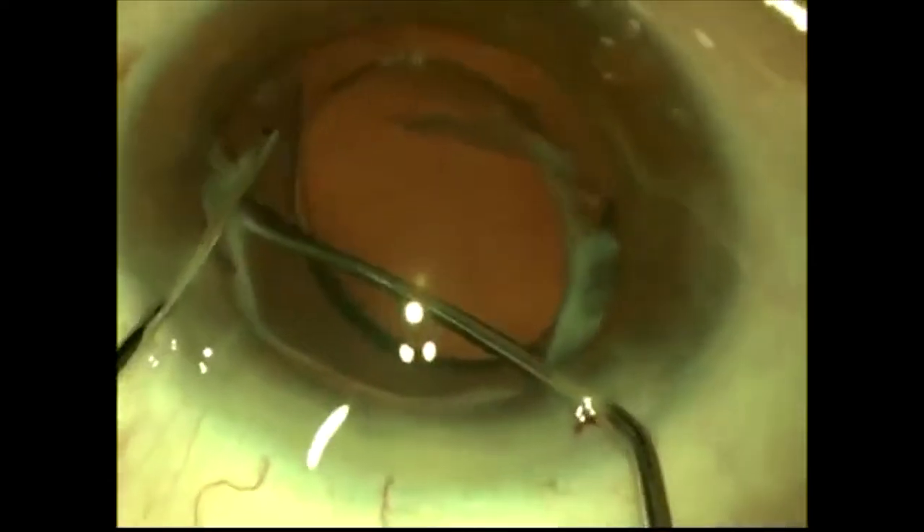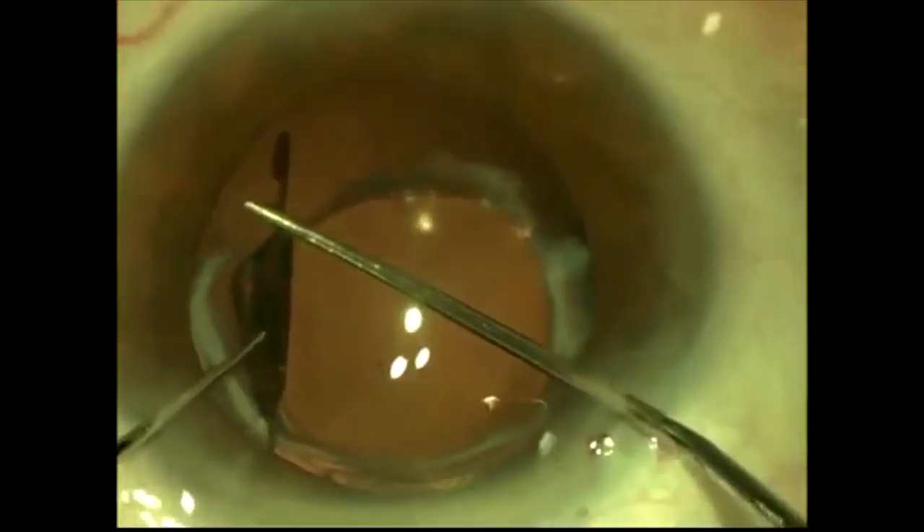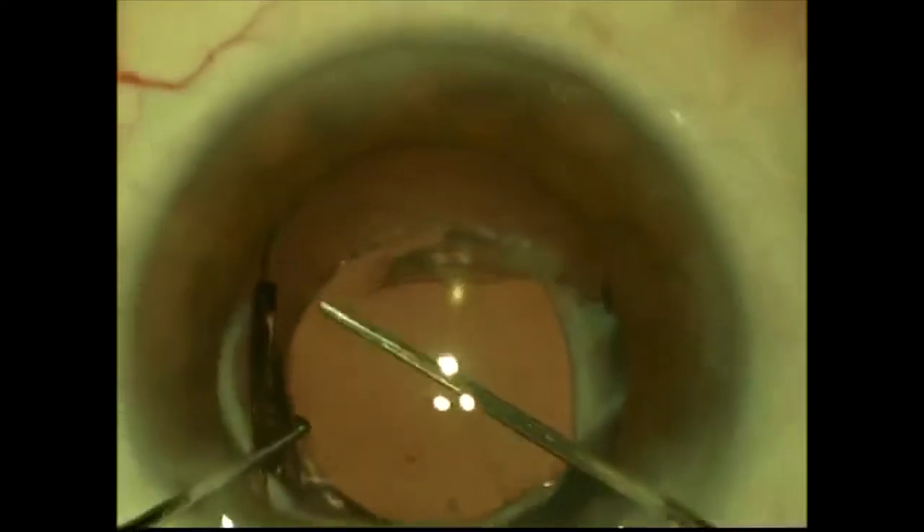So we went back to our incarcerated side and made a decision to put it in the sulcus. These lenses are not to be placed in the sulcus initially. However, in this case, once we've removed all the fibrosis — and the right side of the lens is fibrosed into the capsular bag — placing the left haptic into the sulcus seemed to be a reasonable alternative. We spent most of our time removing the adhesions. I have never had to remove a lens definitively; sometimes I'll remove and replace with another crystal lens, or I can just break the synechiae, remove the fibrous membranes, and the lens ends up in good position.